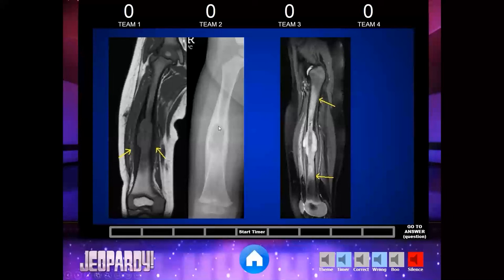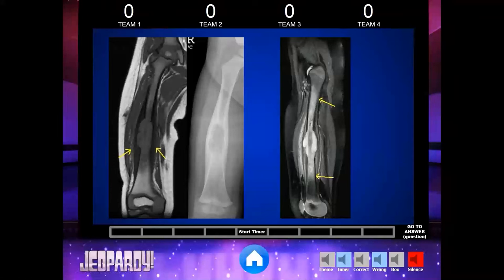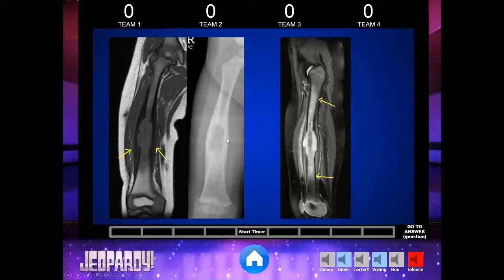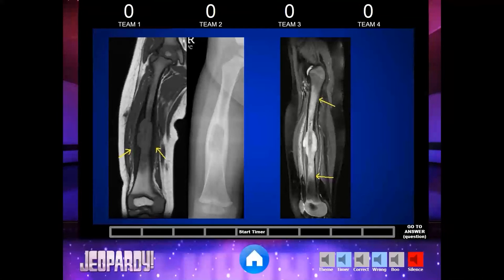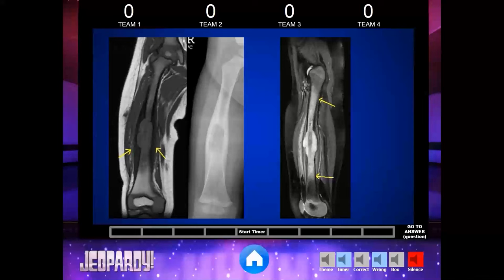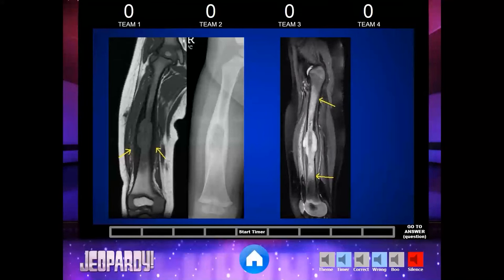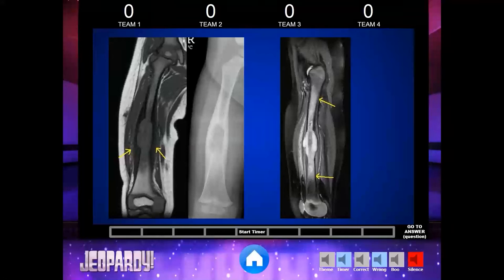That punched-out lytic look — in sarcoma it doesn't really look like that. You can have a metastasis if you have neuroblastoma, but that benign periosteal reaction, a smooth reaction, tells you it's most likely not going to be malignant. LCH can present as a solitary bone lesion with a punched-out lytic appearance. It's important to suggest it because parents want to know there's a possibility it could be benign. It's very stressful for families, and if we just say Ewing sarcoma, they're extremely distressed and it might take weeks to get the biopsy. Always think about LCH.